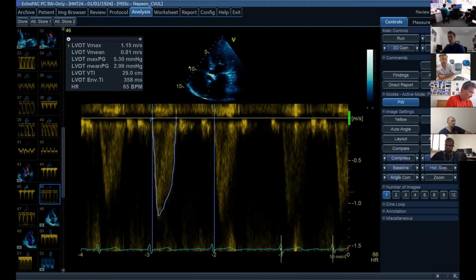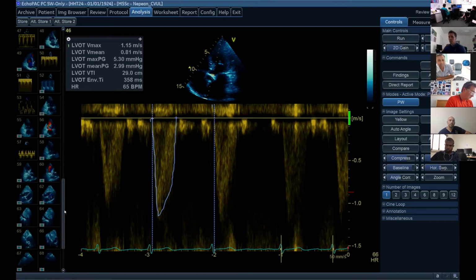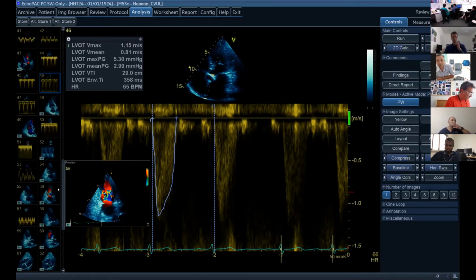Cool. Sam, I have a question. Sure. What do we do when there is atrial fibrillation, or there are changes in the measurements, beat to beat variation? Great question. Yeah, I think it's difficult. I think you've got to take an average of 5 beats.